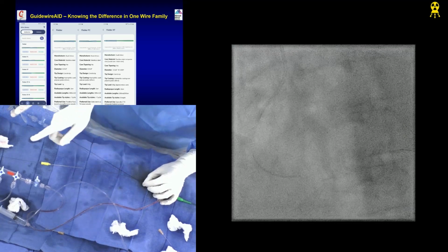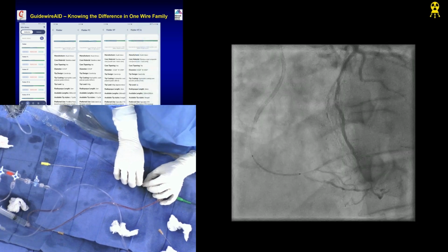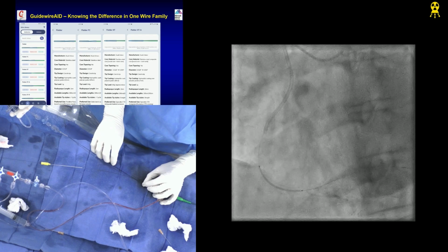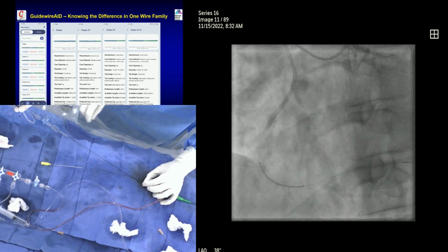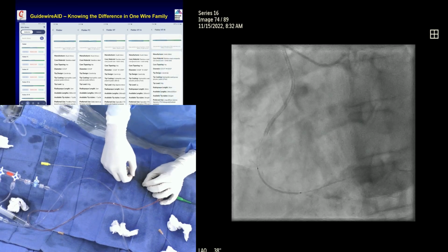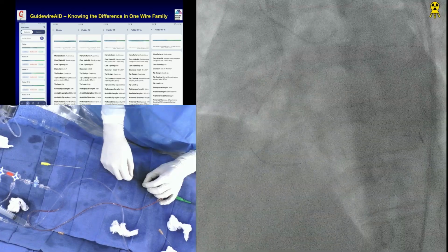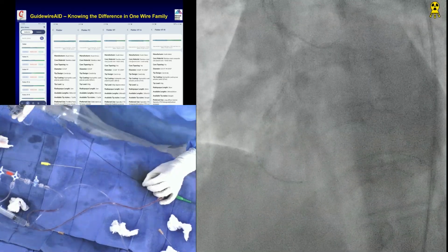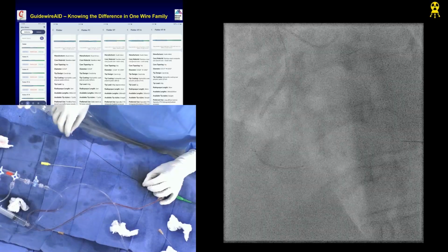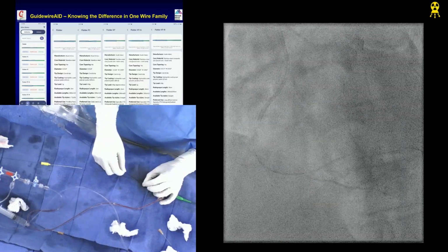But I want to take another cine. What do you think? All I can tell you is, go in, often you put in 1 millimeter. Viewing from the retrograde is the one giving most information. Okay, good. Precisely. Go up.